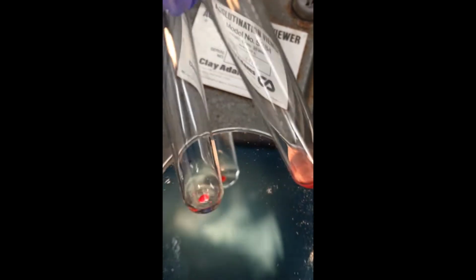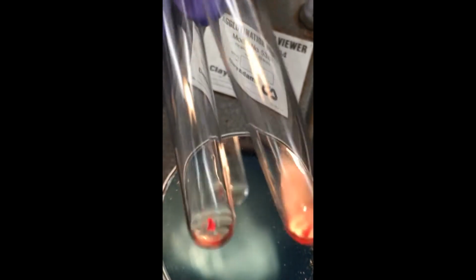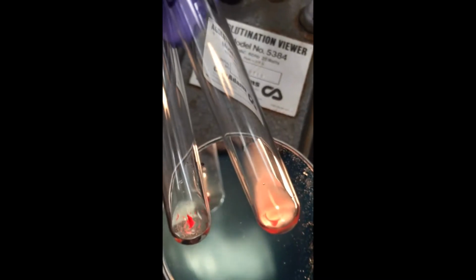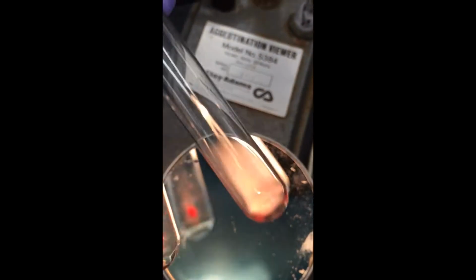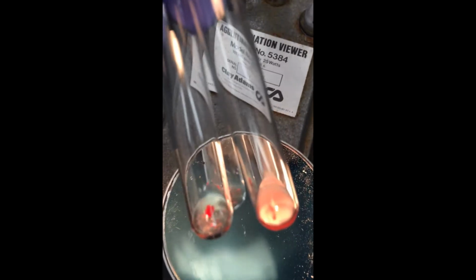Tubes 15 and 16. Tube 15 is on the bottom or the left.